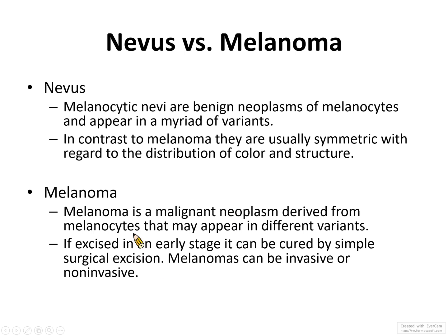But if we just let it grow, it may be very invasive, and eventually will be metastatic. So that is the reason we want to develop a deep learning model. So maybe everyone can have an app that can just take a picture of these skin lesions to diagnose whether the image could be melanoma.